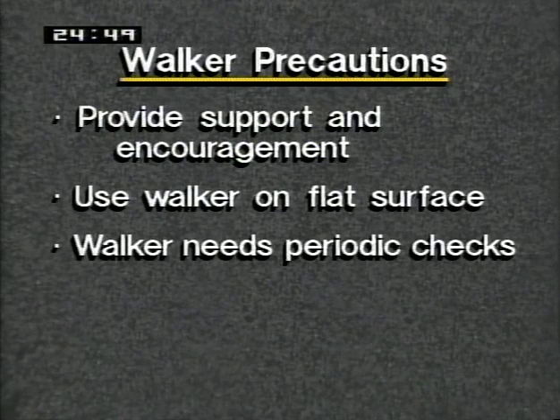And like any equipment, the walker needs periodic checks to be sure that it will not pose a hazard for your patient. When you assist your patient with the walker, you should know which gait, that is, pattern of steps and weight bearing, that your patient should use. Several gaits are possible, depending on the patient's problem. The type of gait is usually ordered by the doctor and taught to the patient by a physical therapist. Because Tom is weak and has no weight-bearing limitations, he follows a normal pattern of walking.